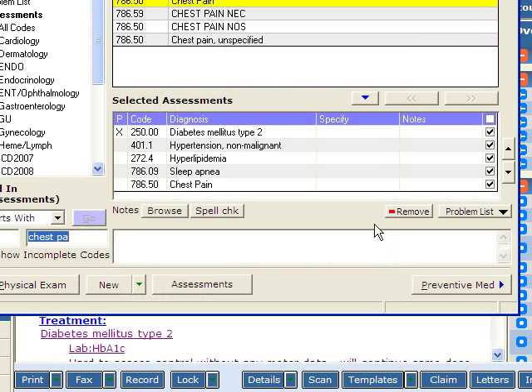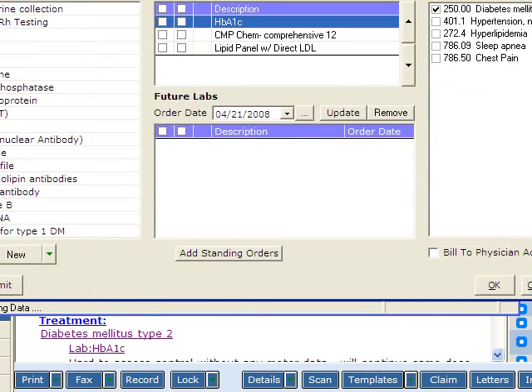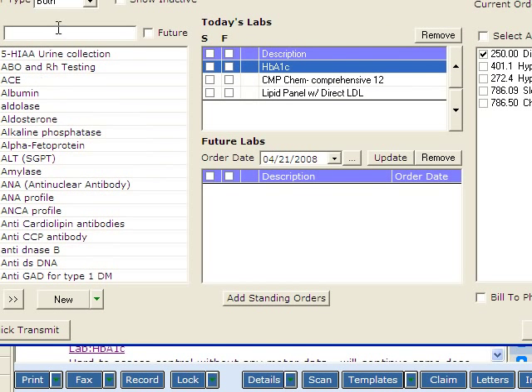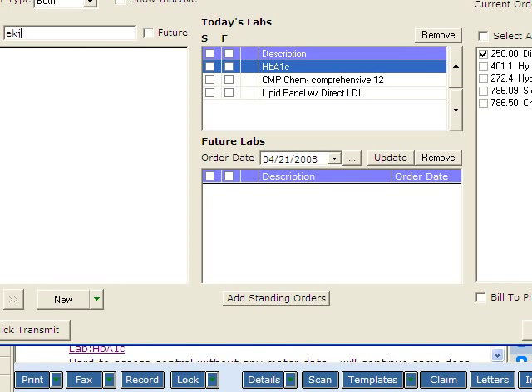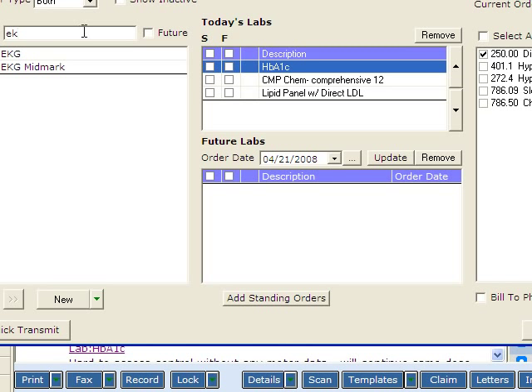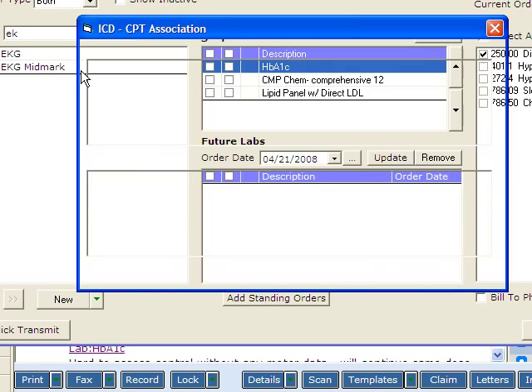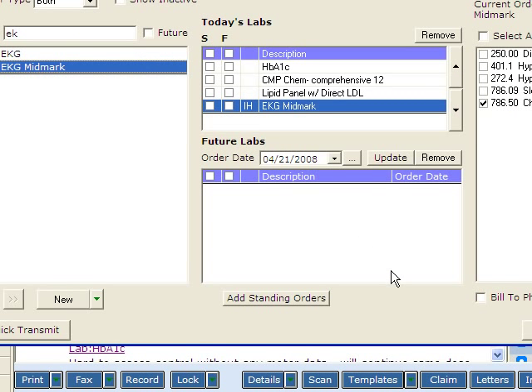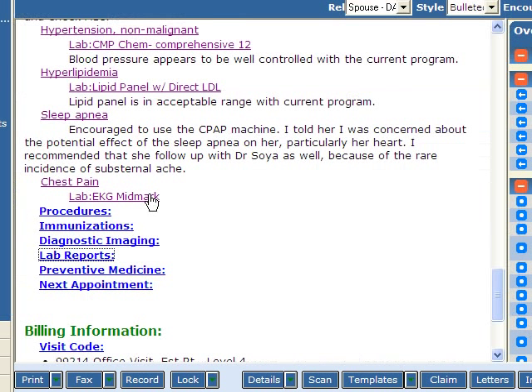Let's see how we actually run the EKG. This is a patient's progress note. I'm just showing you sections because of patient privacy. This is an actual patient that we did an EKG on. We'll look up the EKG. We'll choose EKG Midmark. We're going to do it for chest pain.